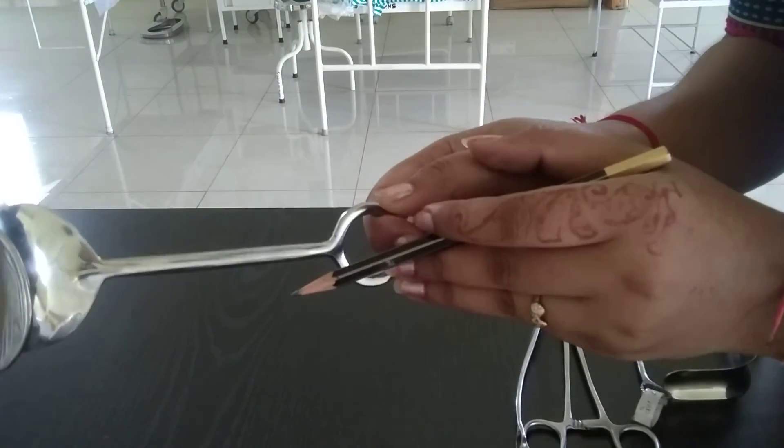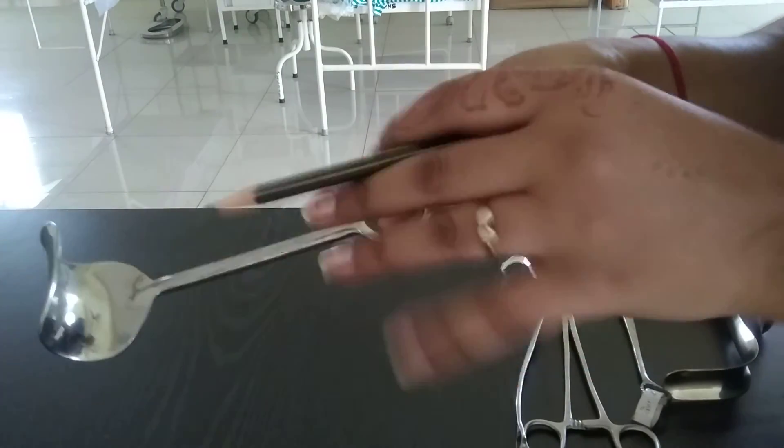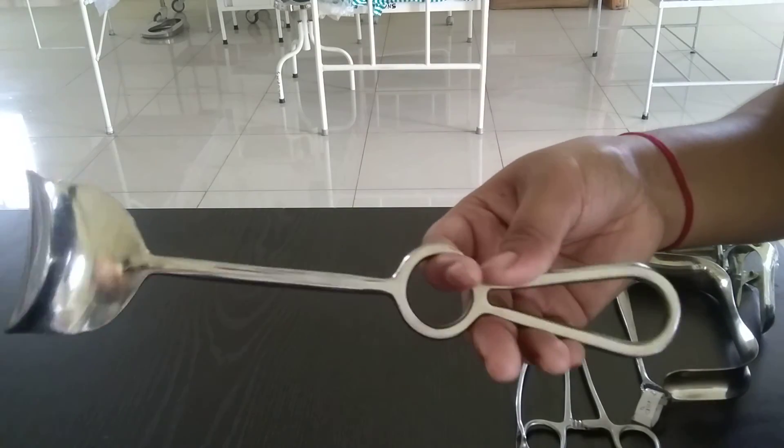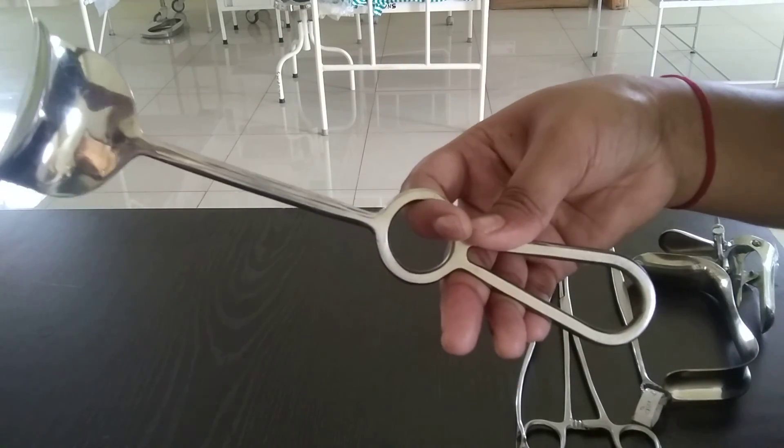These are the uses of Duane's retractor. After use, it is sterilized with autoclaving. So, this is the Duane's retractor.